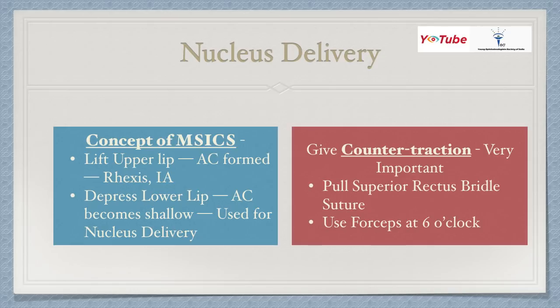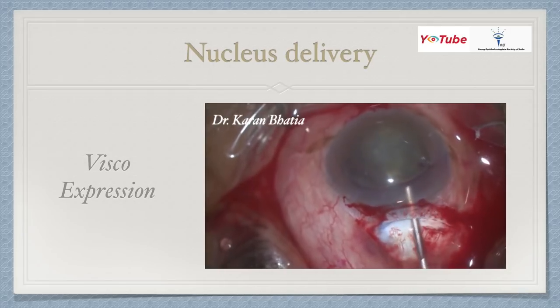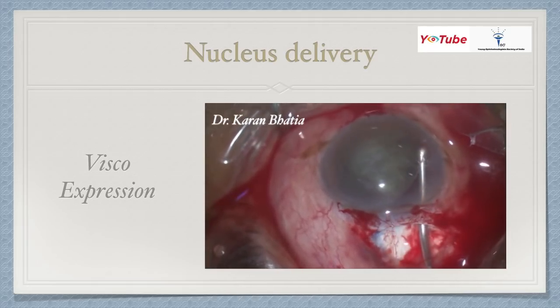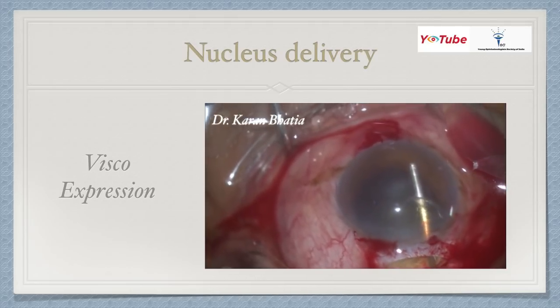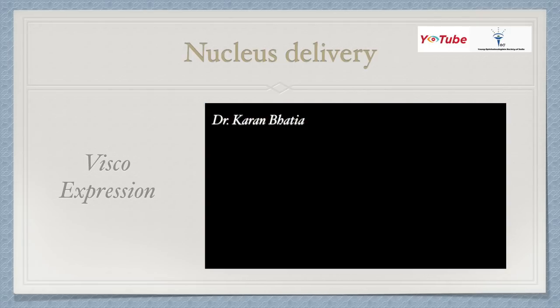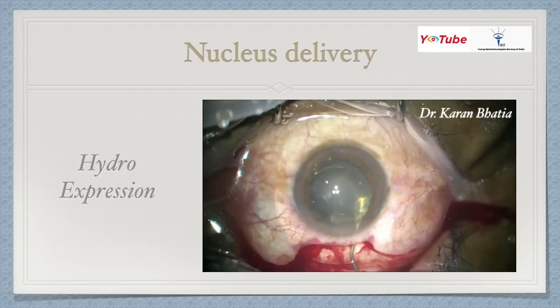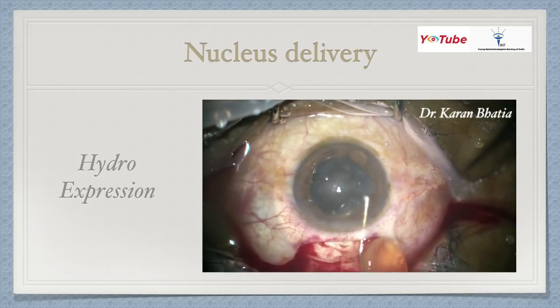Give counter-traction: pull the superior rectus just as you're about to deliver the nucleus through the tunnel, and you can also use forceps at six o'clock for counter-traction. The most commonly used delivery method is visco-expression: inject viscoelastic above and behind the lens, then press the sides of the tunnel and the nucleus comes out. This is very endothelium-friendly and gives very good results. The next is hydro-expression, which requires a bit more experience, where the same can be done using hydro-saline or BSS.